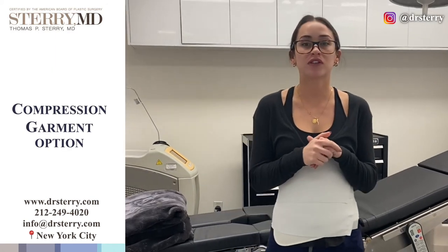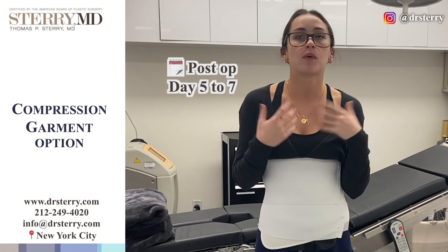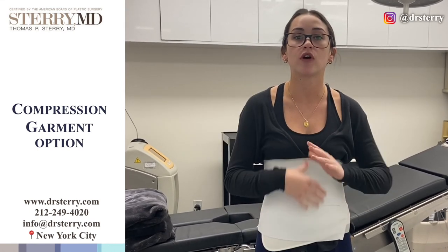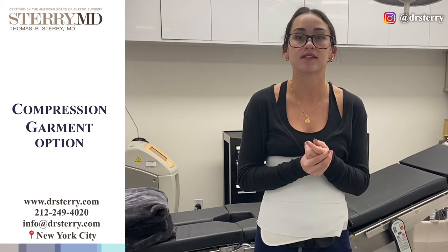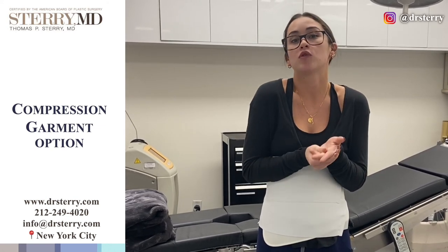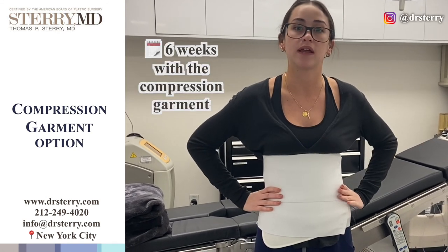After that drain comes out at either post-op day five or seven, we of course welcome you to wear this binder if you find it comfortable, but you can also look for alternative options — the office can send you resources for garments that might be more comfortable for you. You are welcome to wear this, and we ask you for six weeks that you stay in a compression garment.